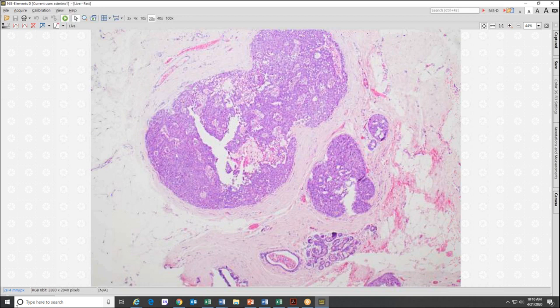We only recently created the dual multiplex stain, mostly to use in small samples, like on core biopsies, where if you did multiple levels, it might get cut through. But the bottom line is, you always want to do at least 2 myoepithelial cell markers, because some myoepithelial cells show different phenotypes. Some are more epithelial, some are more myo in their differentiation. And certain planes of section might not be cutting directly through the nucleus. So we always use 2. I know some of my colleagues always use 3 at different institutions.